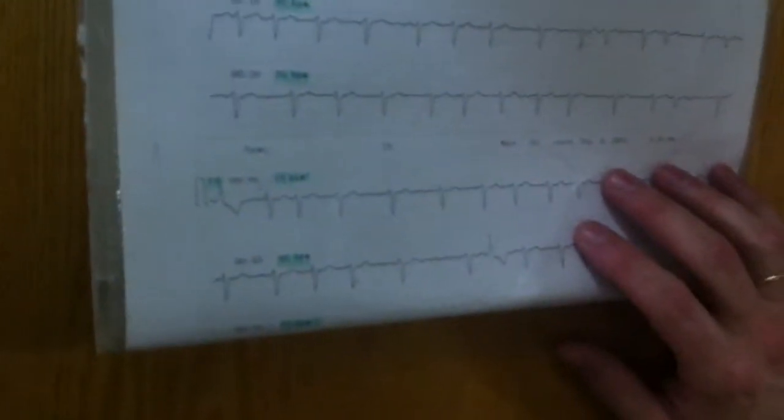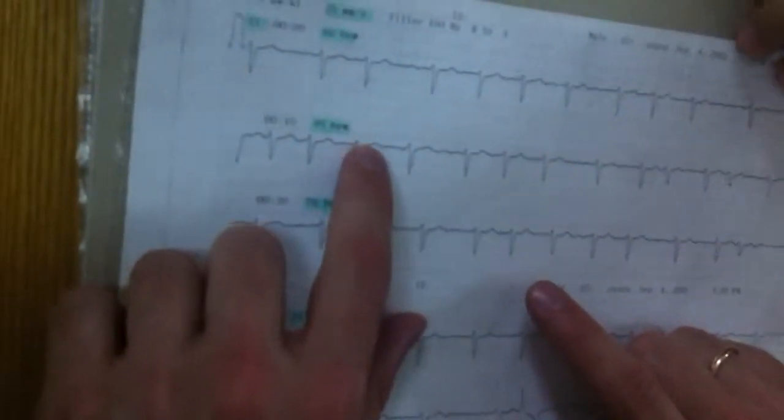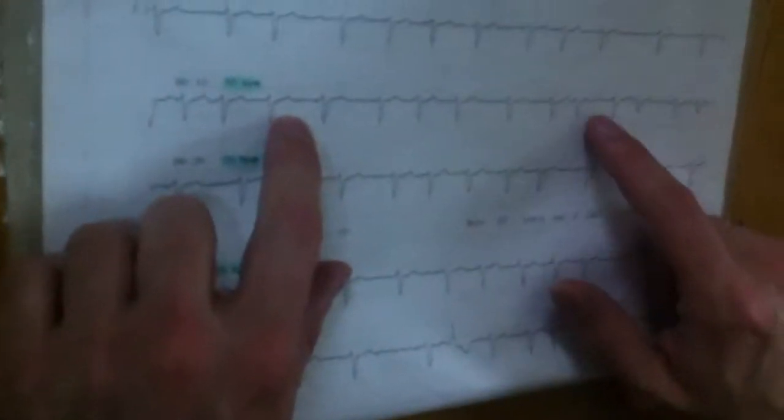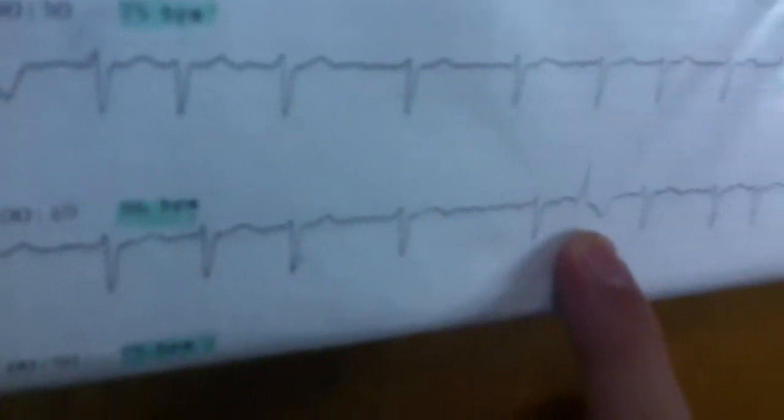Please, what can you say about this ECG? Pathological rhythm, colleagues. Firstly, P wave is absent. RR intervals are not equal. And here are the elements of F waves. It's atrial fibrillation, and you can see also the premature ventricular complex.